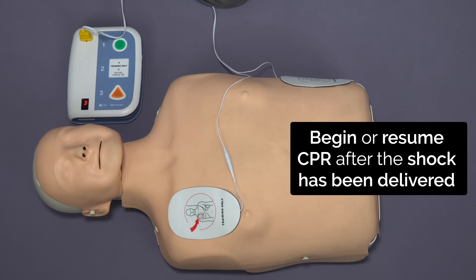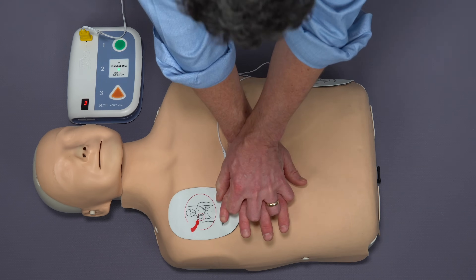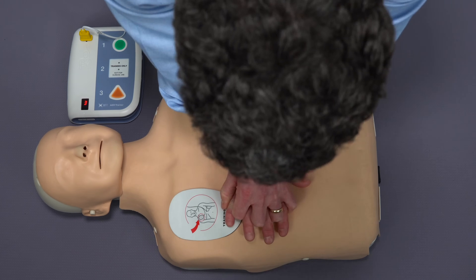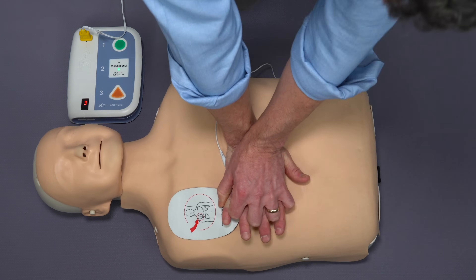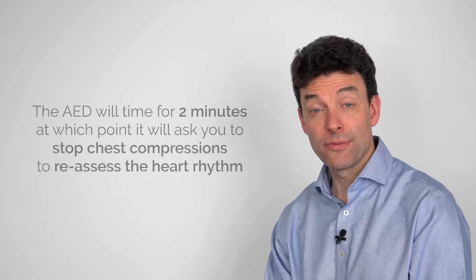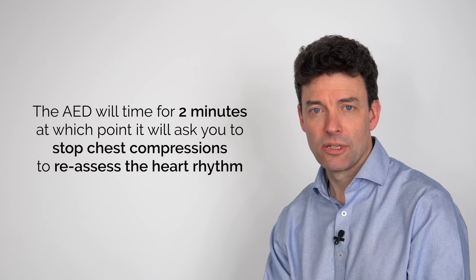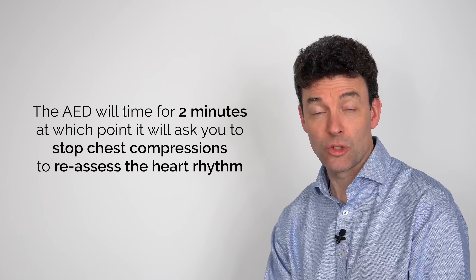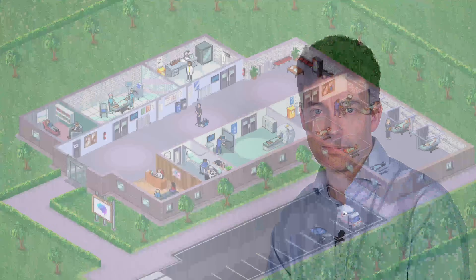After you've delivered the shock, you'll need to continue CPR. Then the defibrillator will time for two minutes, at which point it will ask you to stop doing CPR and it will reassess the rhythm.